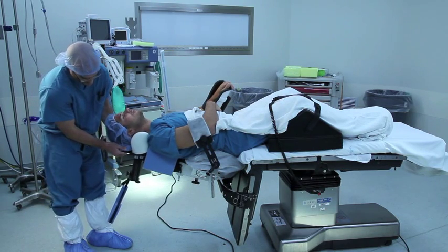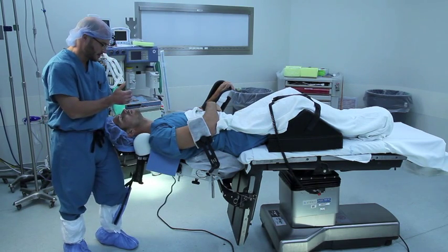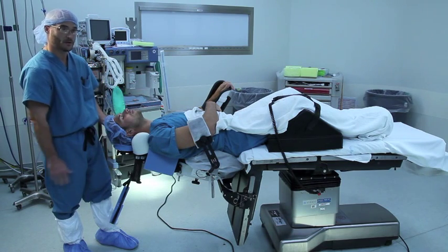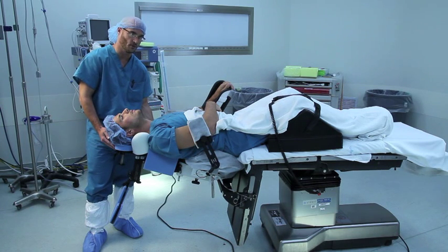Allowing the head assembly to free float allows one to compress here during intubation, which will assist in the intubation process. Additionally, if a manual thoracic support is needed, that can be done as well.